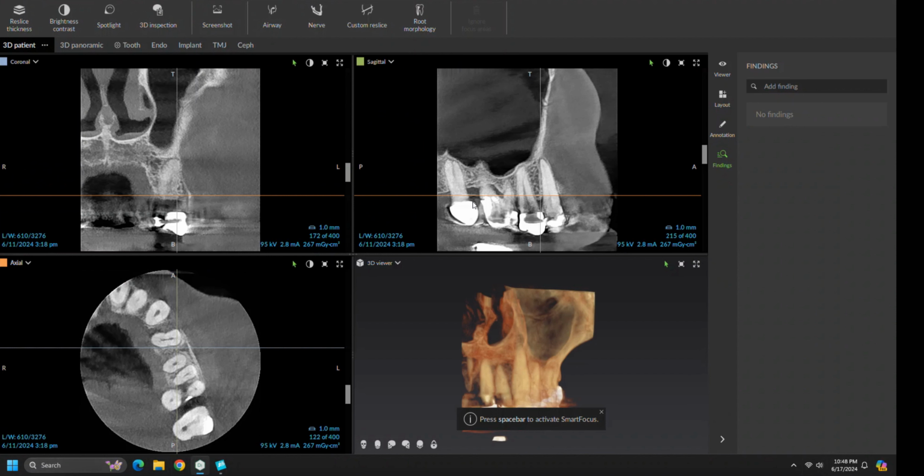So let me know if I can help any further. Looks like the patient benefited from the CAT scan by being able to confirm the presence of a crack. Take care.